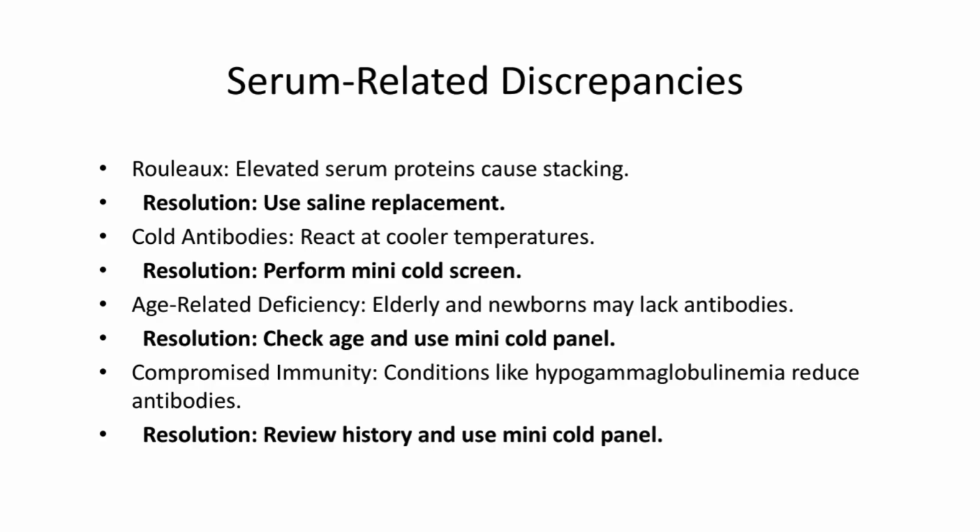Third, age-related antibody deficiency. In elderly individuals, antibody production may decline, while newborns may not yet produce sufficient antibodies. This can result in missing expected reactions. Resolution: A. Check the patient's age. B. Use a mini cold panel to enhance detection of weak or missing antibodies.